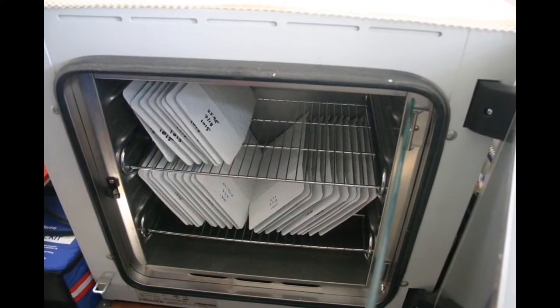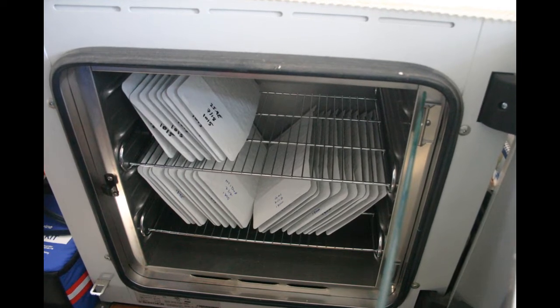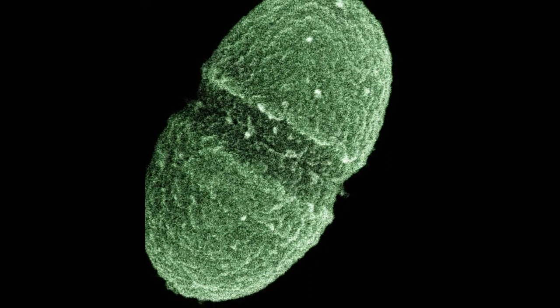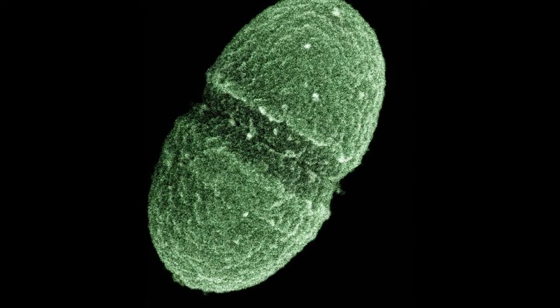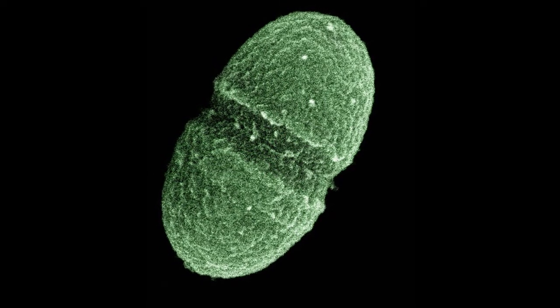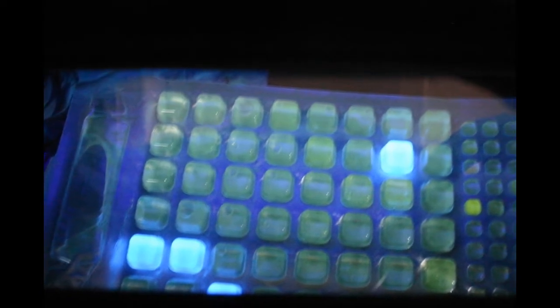Next, the water samples are sealed in a special tray with lots of different plastic cells. Then the trays are put in an incubator, where they are kept warm for 24 hours. This helps the bacteria grow even more. As they grow, the bacteria eat more of the special food with the dye in it. After 24 hours, they have eaten enough food to make the water in the cells glow when you place them in a special ultraviolet light. The more cells which are lit, the more pollution is in the water.